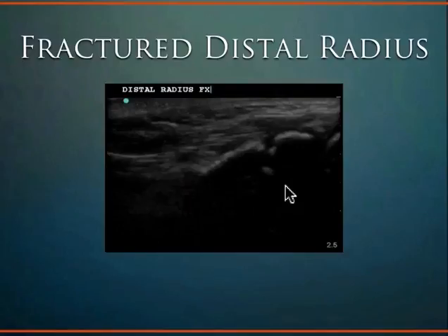So when you're doing an ultrasound, you put so much gel on it. You can get gel out of the refrigerator. I always keep the bottle in the refrigerator. And so you can put some chill gel on there, and then you don't even touch the skin. The ultrasound touches the gel, and then it's actually painless to do an ultrasound for a fracture, as long as you're not moving the bones. Once you start moving the bones around, then the patient will let you know about it. For sure.